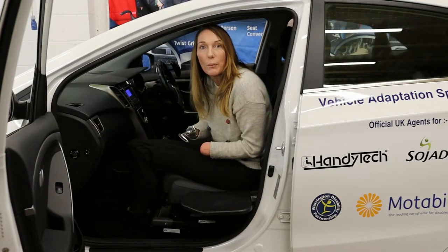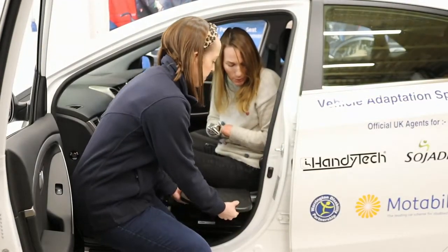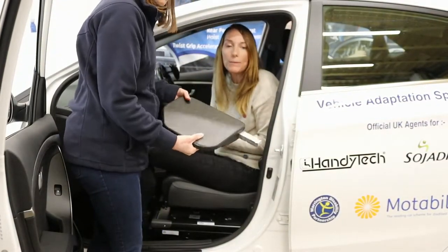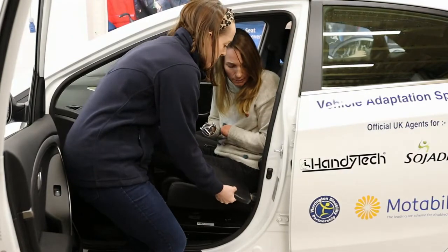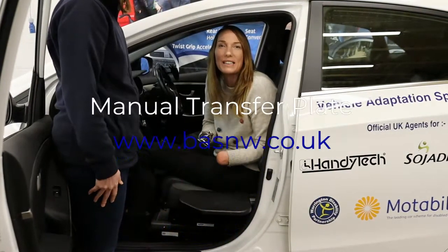I'm just demonstrating this here — it's very simple. Lift it up, out it pops. To put it back in, you just press it in. But you would need a certain amount of strength and dexterity to be able to do that.